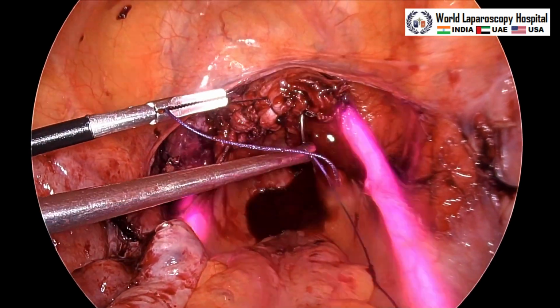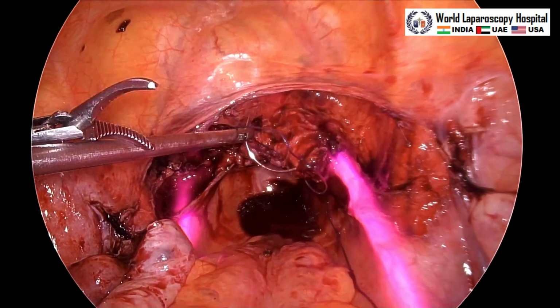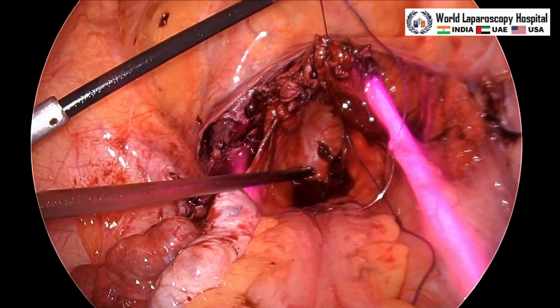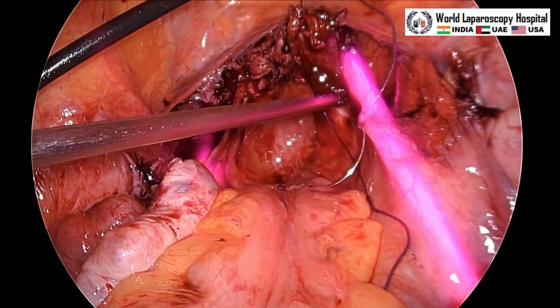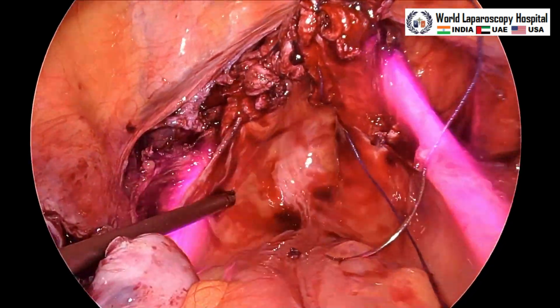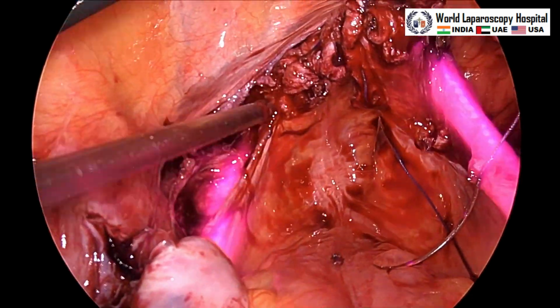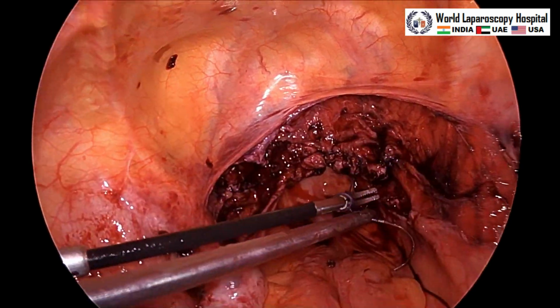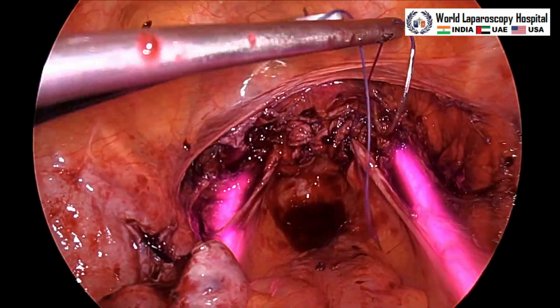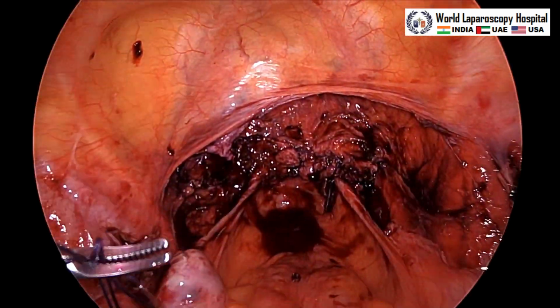And this is the last bite on the right corner, and this also is locked. After that, with the starter tail, we will terminate it here. A little suction irrigation will be performed. So hardly 5 ml blood loss is there. We have not used suction irrigation any time during surgery. At the end, just a little bit was performed, and now it is terminated and the needle will be taken out.